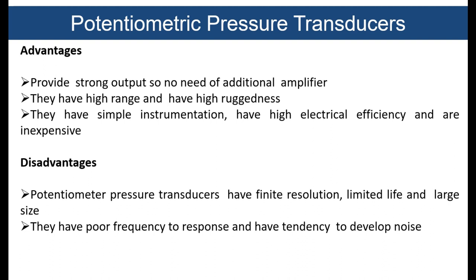Whenever you are applying the pressure, you have to notice whether the change in resistance is happening or not. Otherwise, you will not be able to get the response data. So you have to clearly apply the pressure at the proper interval of time. Parallelly, the tendency to develop noise arises because the wiper is moving over it, which gives you a noise pattern. So that is also not very feasible.